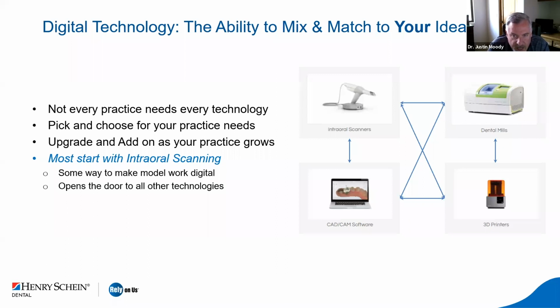Intraoral scanning sometimes leads to in-office milling. Sometimes it leads to the design of the crowns or surgical guides or whatever that might be. It may lead to printing these things, whether it's a model or a surgical guide, or it could lead you to being a one-stop shop, having all these assets in your practice.